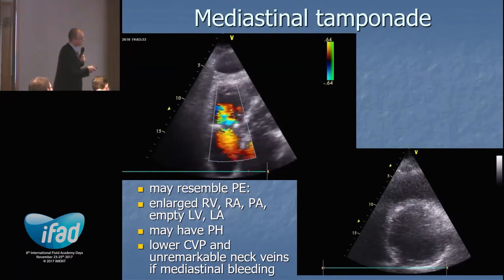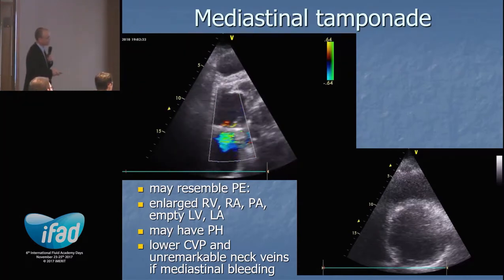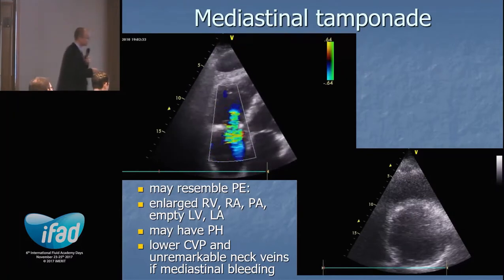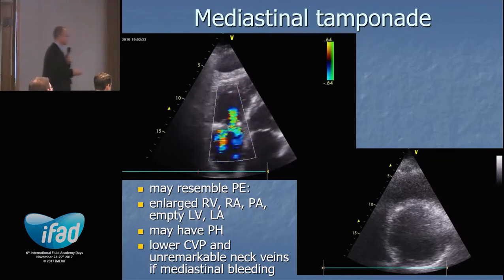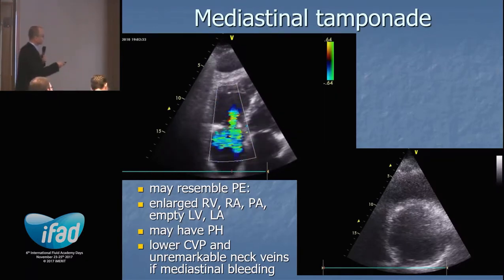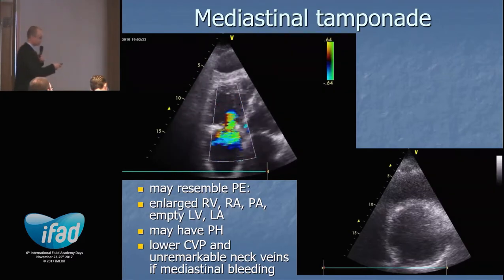This is a patient after tricuspid annuloplasty, and this loop, unfortunately, is jammed again, and I wanted to demonstrate a paradoxic subtle motion. This is a short axis of this heart. This gentleman had drainage of this collection above the pericardium and mediastinum through the parasternal approach.